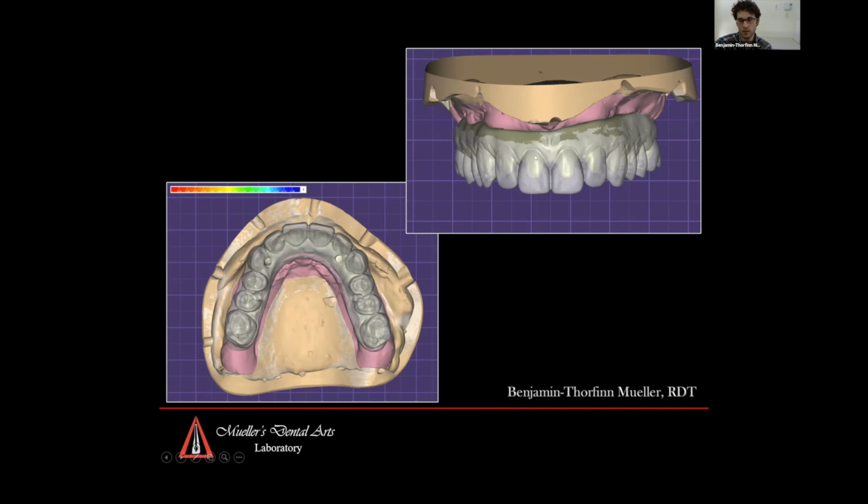So you have to make the prep longer, so that when you make your crowns, they're actually 1 to 2 millimeters longer than your actual clinical crown will be, so that you can sink those margins below the tissue that you will later layer.